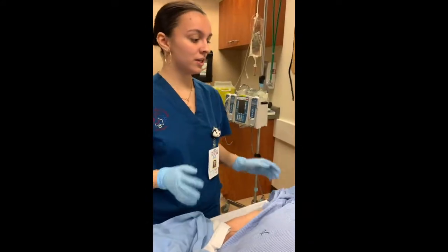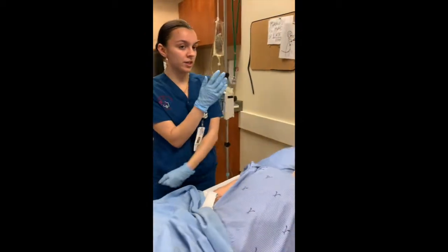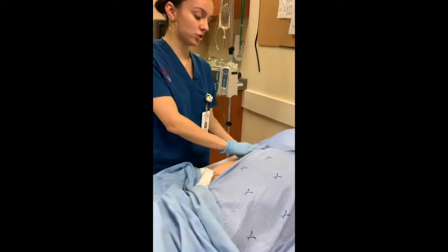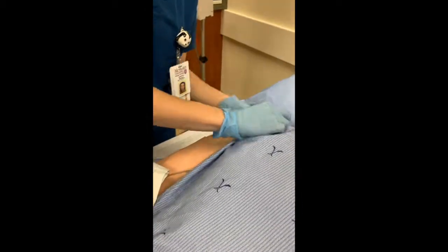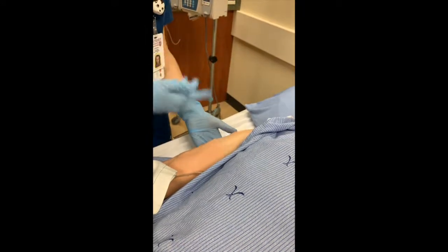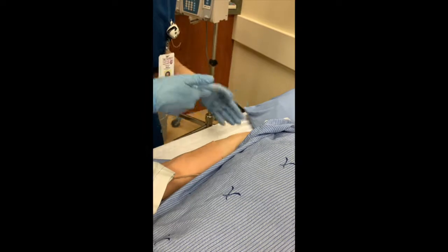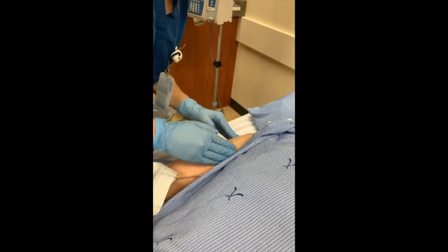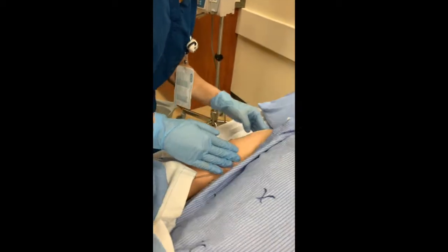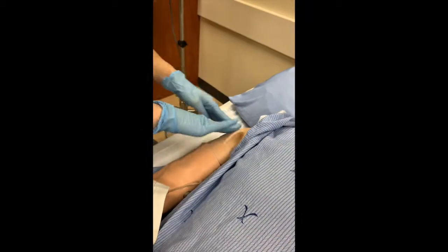Now, Mr. Mancini, we just completed your subcutaneous injection. I'm going to be giving an intramuscular injection of haloperidol on your deltoid, which is the muscle on your shoulder. So what you also want to do is inspect and palpate the area, just looking once again for any masses or tenderness or any lesions or anything that's going to be painful around the area. Just palpating, and you're also inspecting, seeing any facial expressions indicating any pain. So overall, everything looks within his limits, so everything looks normal here.